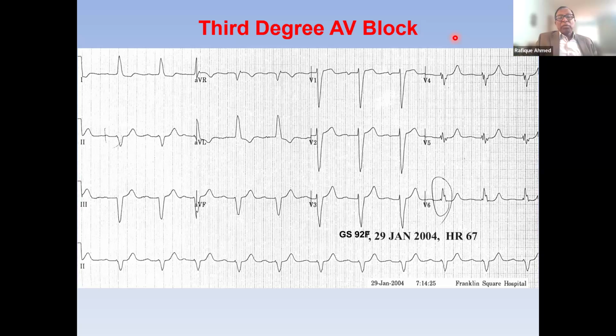Yeah. So what we do, anybody with an HV interval of 100 with syncope, or even without syncope, with conduction disease, they get pacemakers. Between 70 and 100, anything over 70 with syncope, we consider a pacemaker with bundle branch block. But in your case, I think that is a good decision. HV is 55 milliseconds. That's the longest you could get. And you just follow this patient. And remember that 80% of patients never had a second syncope in real practice.